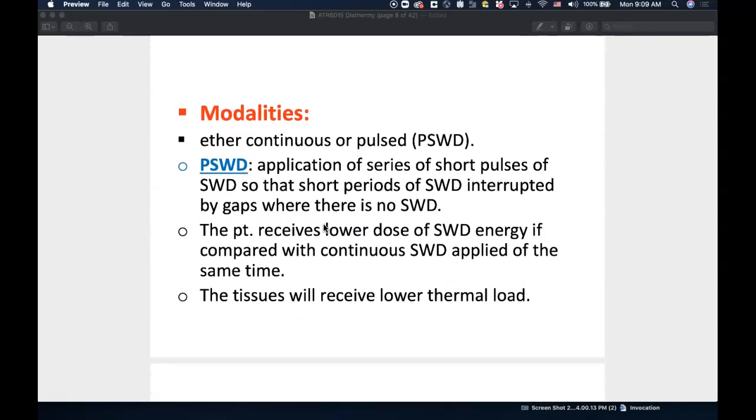So we know about shortwave diathermy is that it can be continuous or it can be pulsed. Does that remind you of something, you guys? Remind you of therapeutic ultrasound a little bit? Yes. So your continuous treatment, right, is going to be very thermal driven, right? And your pulse treatment certainly can be thermal, but most often it's used for its non-thermal effects. So think back to therapeutic ultrasound and think about those non-thermal effects, right? The micro streaming, the micro bubbles, the eddies of water, right?